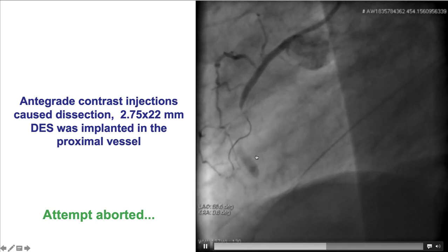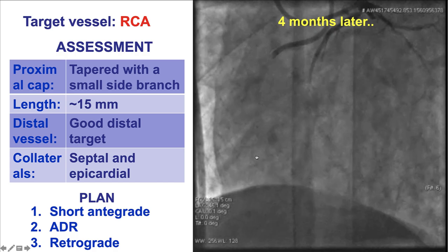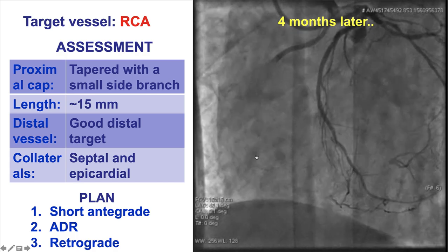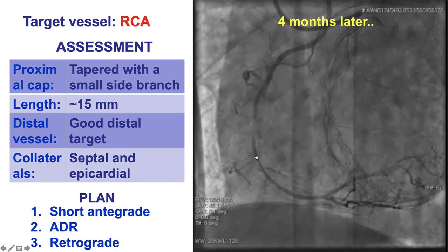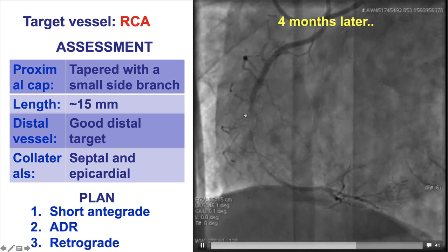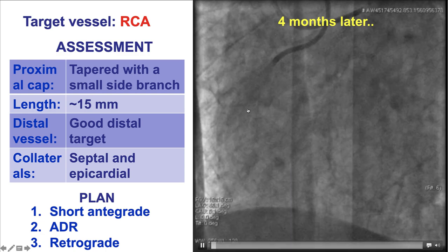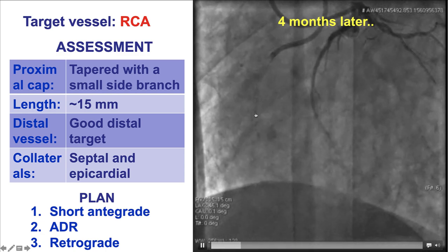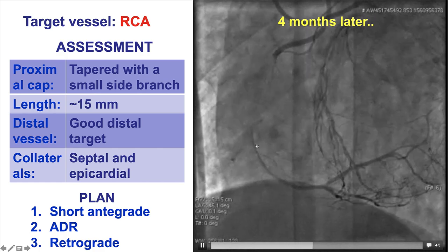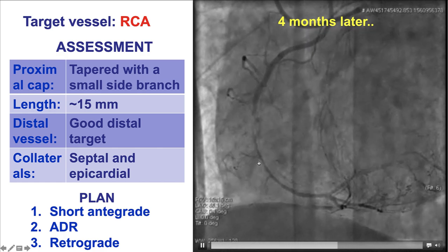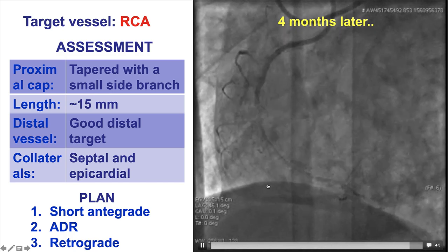The CTO PCI attempt was aborted and the patient returns now four months later for a repeat CTO PCI attempt. There is still some residual dissection of the proximal cap. The length of the occlusion is short, about 15 mm. The distal vessel has some disease and there are septal as well as epicardial collaterals.